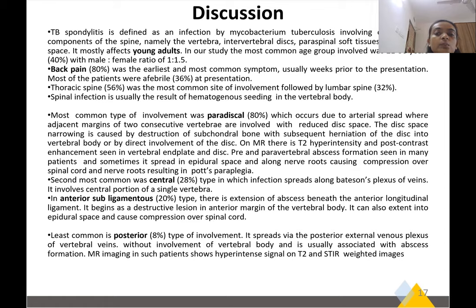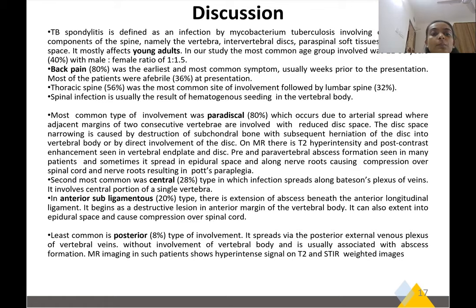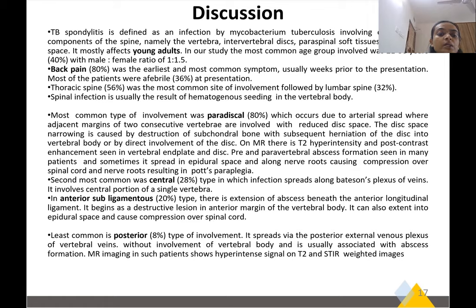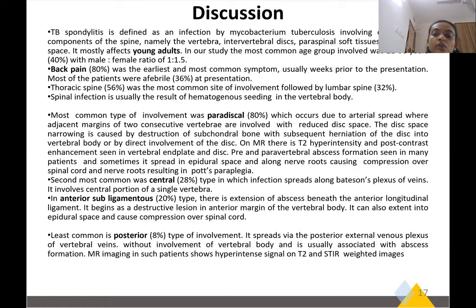On MRI, there is T2 hyperintensity and post-contrast enhancement seen in the vertebral endplate and disc. Pre- and paravertebral abscess formation is seen in many patients, and sometimes it spreads into the epidural space and along nerve roots, causing compression over the spinal cord and nerve roots resulting in Pott's paraplegia. The second most common type was the central type, where infection spreads along the Batson's plexus of veins and involves the central portion of a single vertebra. In the anterior subligamentous type, there is extension of abscess beneath the anterior longitudinal ligament, beginning as a lytic lesion at the anterior margin of the vertebral body, which can also extend into the epidural space.